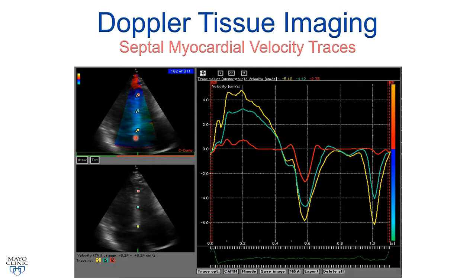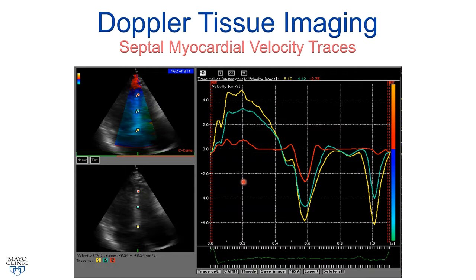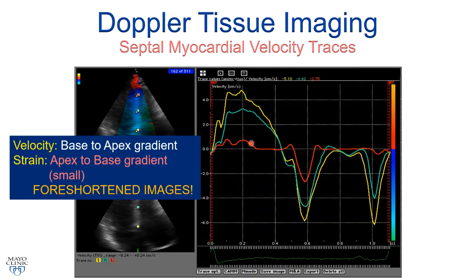Here we see an example of septal myocardial velocity tracings, with the sample volume placed in the base, mid, and apical portion of the septum. We see the systolic velocities towards the apex, the early diastolic relaxation or E prime velocity, and the late diastolic myocardial velocity associated with atrial contraction — the A prime velocity. Note there's a base-to-apex gradient in velocity, which means you'd have to determine normal values for each segment.